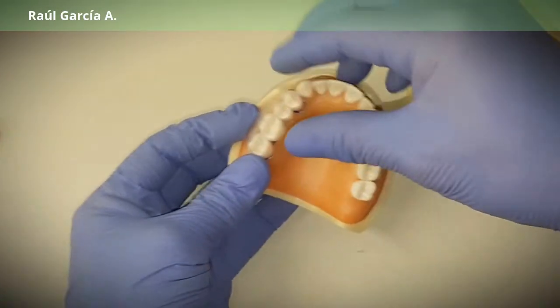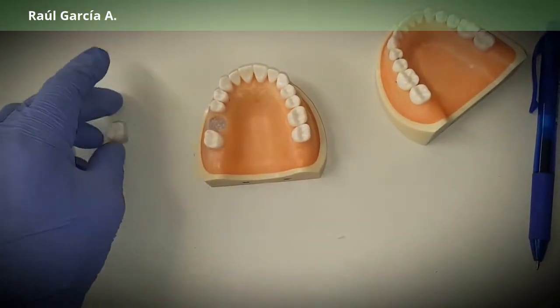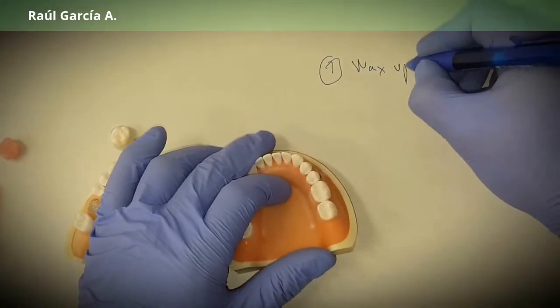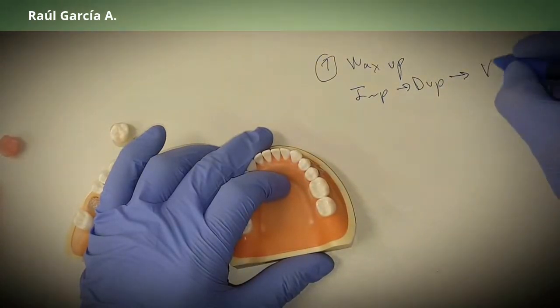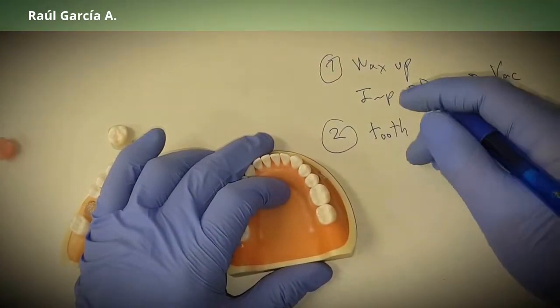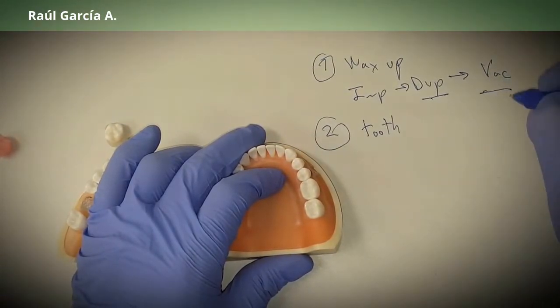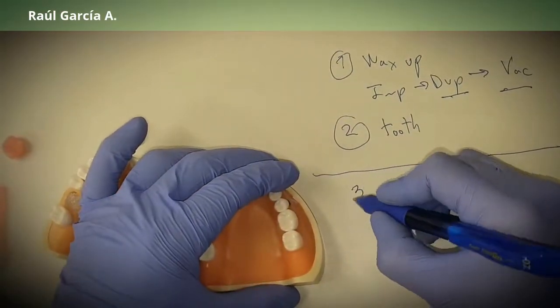So those are the two regular options. To recap: first option — do a wax-up, take an impression, duplicate the model, and do your vacu shell. Second method — find a stock tooth like you'd use for complete dentures and do the same procedure: take impression, duplicate your model, take it to the vacuum shell. Always duplicate the model first, then take it to the vacuum shell.